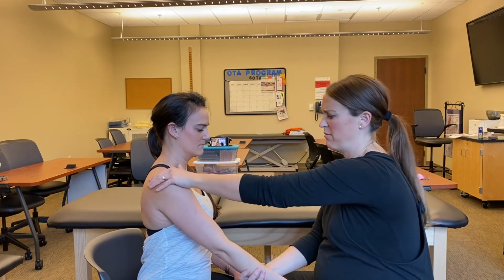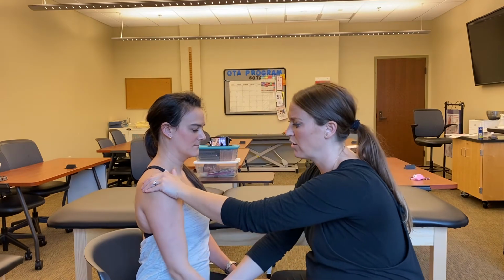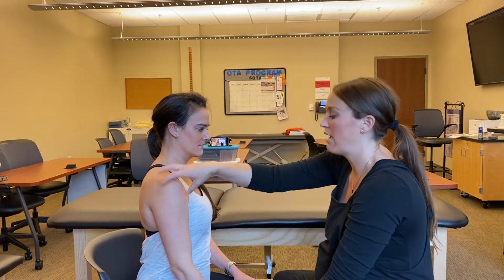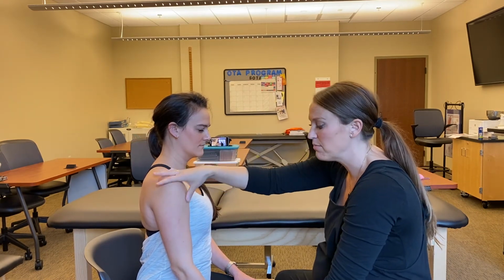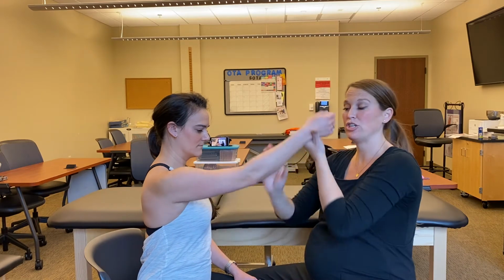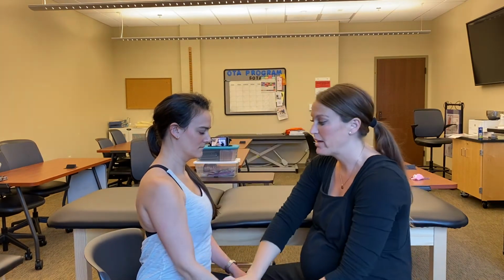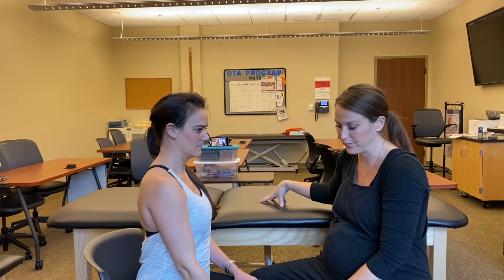So if I do passive range of motion, and passive range of motion equals active range of motion, so I get here and I'm kind of like, oh, I'm stuck. I can't go any further. Then that means that structurally something is going on here. She may have an old injury, she may have frozen shoulders, she may have severe arthritis, something structurally is happening here, okay? So if passive range of motion is greater than active range of motion, you need to take your patient to gravity eliminated and look at range of motion in the gravity eliminated plane, okay?